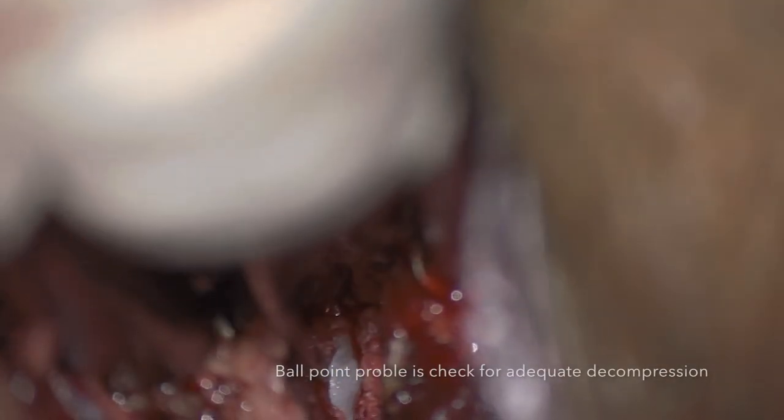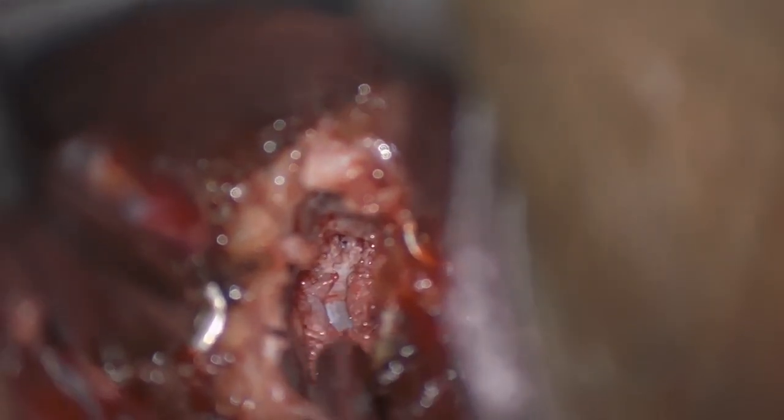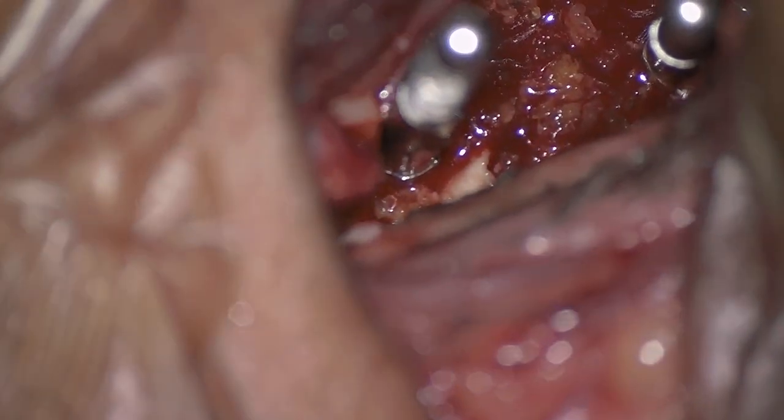Before finishing the discectomy, it is important to check that all four corners have been completely decompressed. A ballpoint probe is very safe to confirm the adequacy of the decompression. This is the end of the C4-C5 discectomy, and the dura at C4-C5 is completely decompressed. The next step is to perform the discectomy at the proximal level, which is C3-C4.